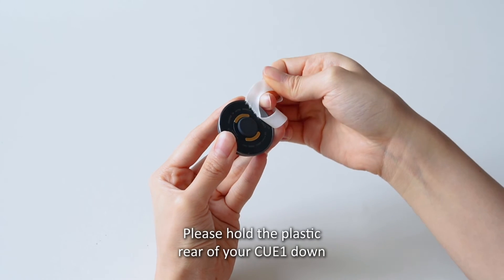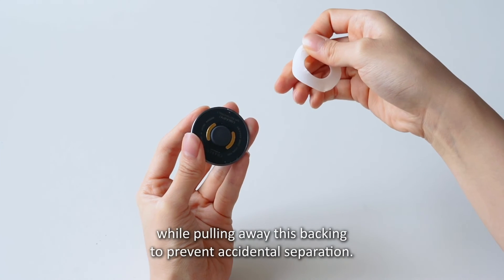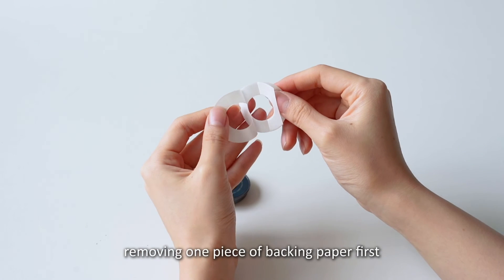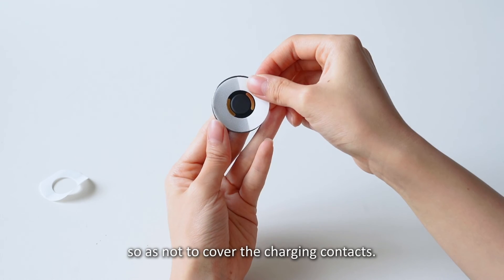Please hold the plastic rear of your CUE1 down while pulling away this backing to prevent accidental separation. Apply the new backing in a similar way to your sternum patch, removing one piece of backing paper first and taking care to line up the hole so as not to cover the charging contacts.